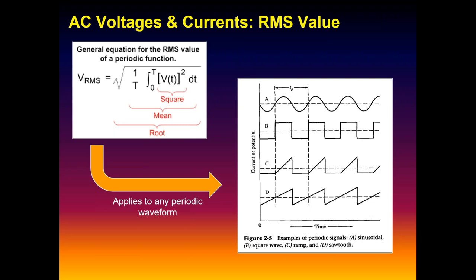Have you ever seen any of the neurally controlled prosthetics that are out there, arms and limbs that are controlled by EMG, the electrical muscle activity off of our body? Those artificial neural controlled limb prosthetics are driven by RMS signals from the EMG. We do an RMS conversion on the raw EMG. We get a DC signal that's pretty proportional to force or effort.